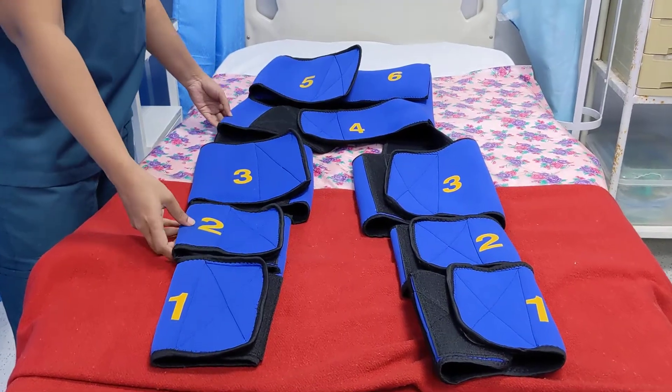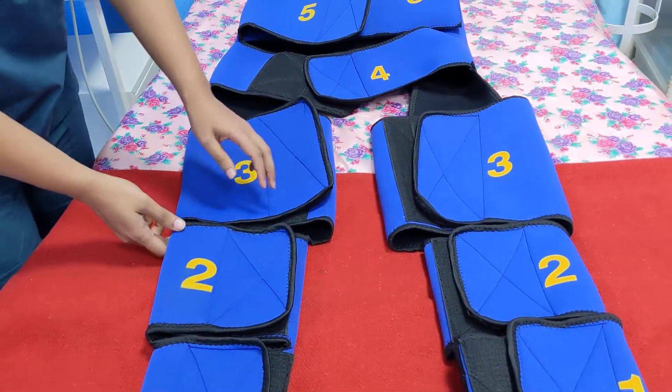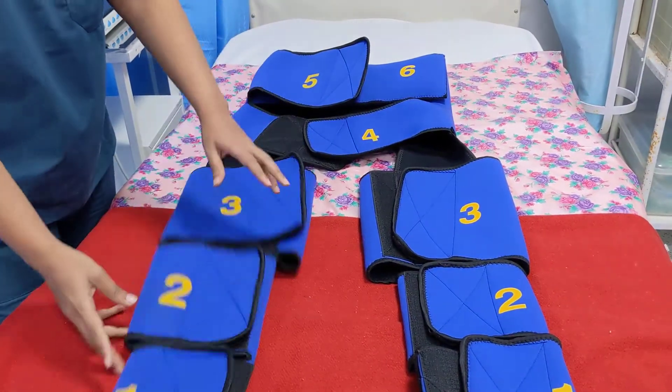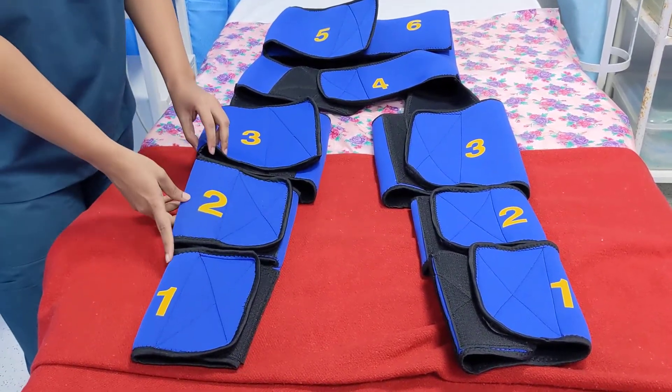As we put this garment on the patient, it is important to note that the knee joint should fall between segments 2 and 3, so that the obstetrician is able to flex the knee easily to place the patient in a lithotomy position for performing various procedures like PV examination or inserting a tamponade balloon.